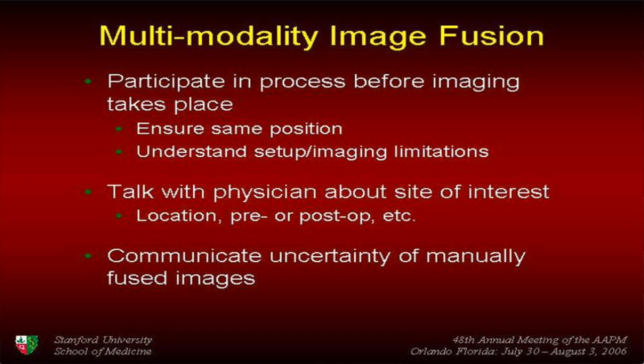Before you start the fusion, talk to the physician about the site of interest. What's the location? It's not enough for the physician to give you an MR scan and say, please fuse it to the CT, the treatment planning CT. You need to know, is this a pre-op? Is it a post-op? Is there a surgical defect? What site actually in the head are they interested in? Is it nasopharynx? Are they more interested in the neck region?